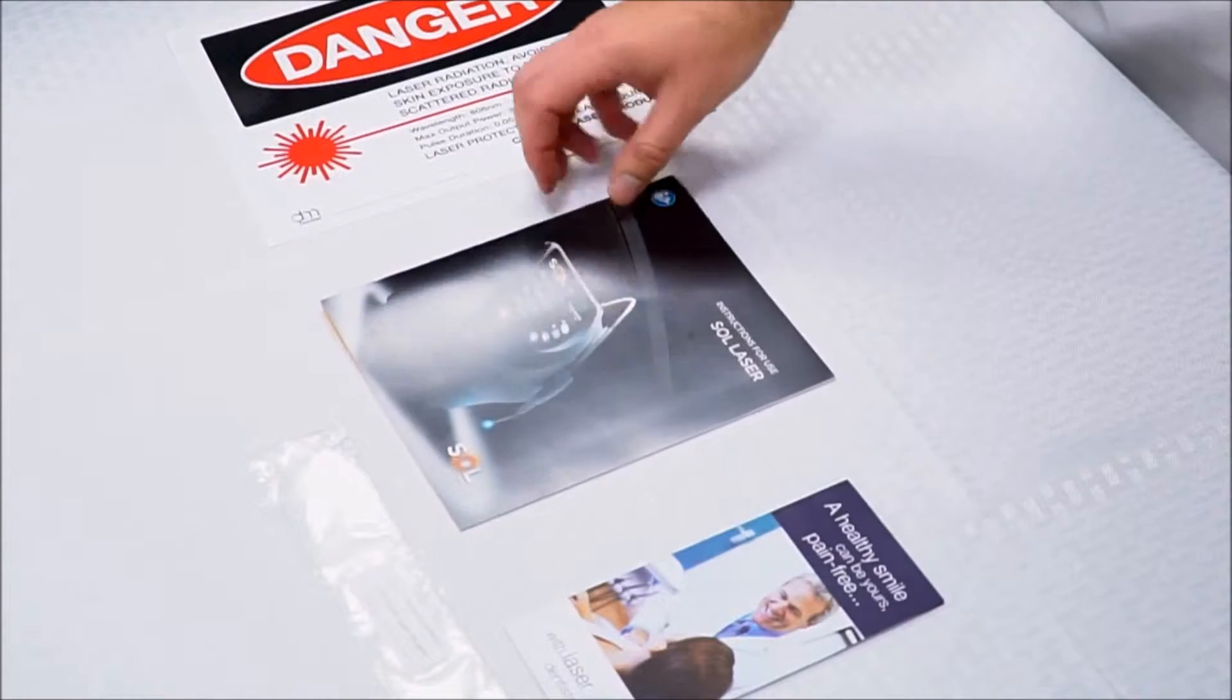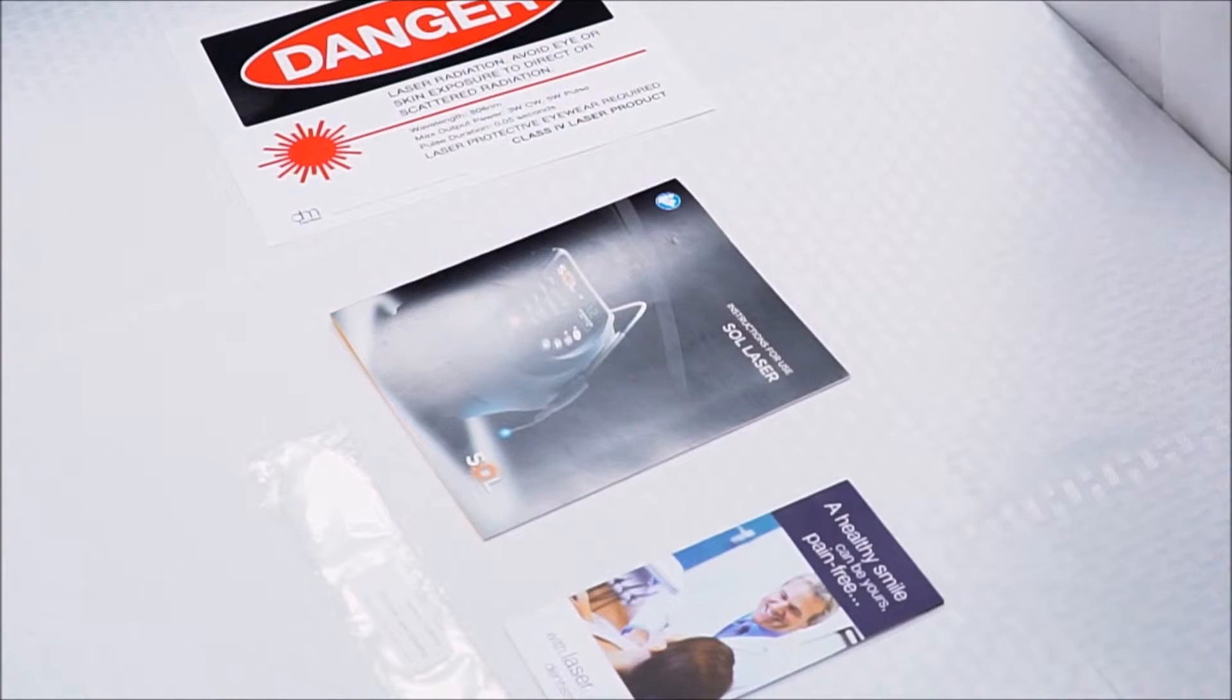Of course, next you have your directions for use. This will go over all the indications and contraindications for this unit.